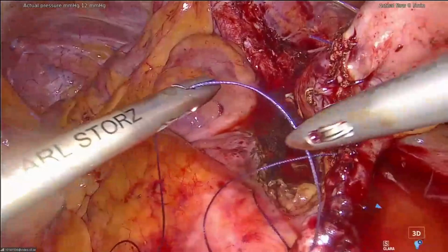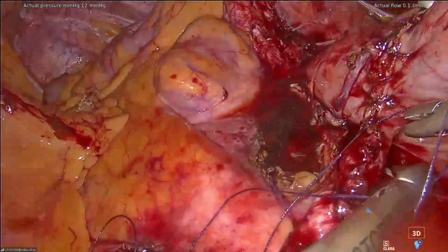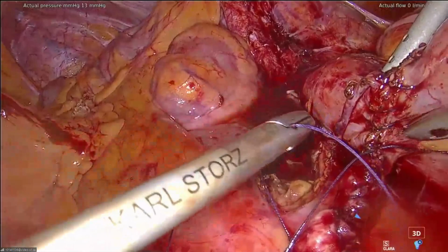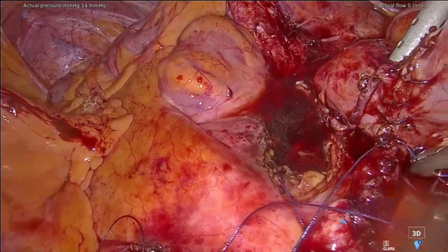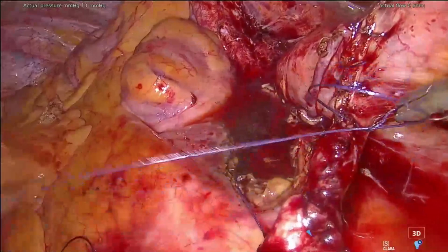The Monti principle is you take all the circumference of the bowel, because it's an organ that is very well vascularized, and you can cut really near the meso, and all the flap that you develop from the other side will stay vascularized, and that's the advantage. It's not the rule 1:2. You can be at 2 centimeters wide and 6 centimeters. That is more 1:3, the proportion that you can take.